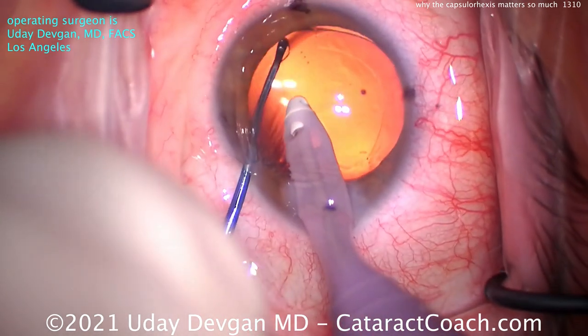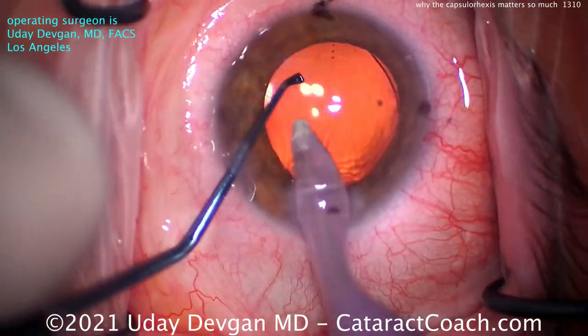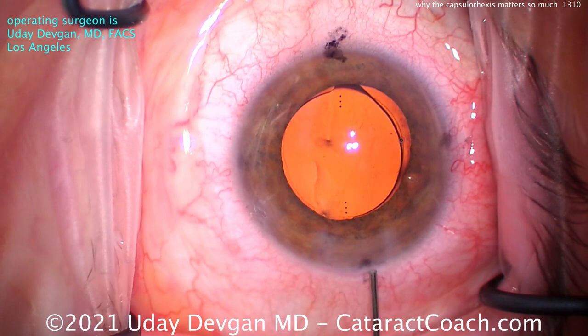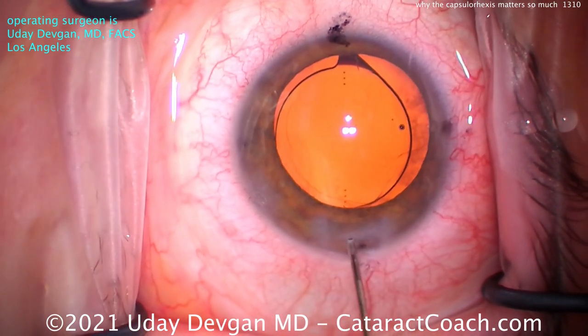We want to maintain that 360-degree overlap. You don't want too small of a rhexis. With a smaller rhexis — say, a 4-millimeter rhexis — it's a lot easier to keep that 360 overlap, but it's a lot tougher to remove the cataract. Plus, that can be more prone to having capsular phimosis.